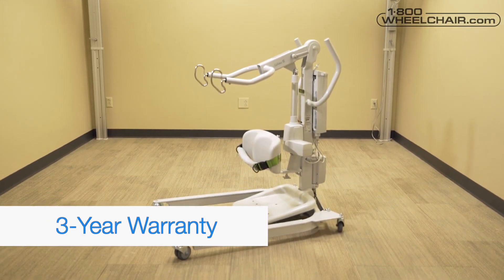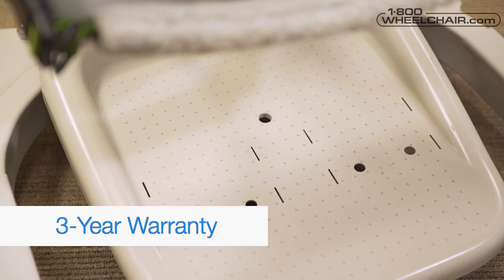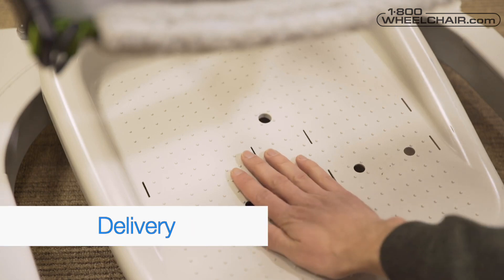Warranty: we have a three-year warranty on the frame. White glove delivery: there's an option for home delivery and setup if you need the extra care. What sling should I use with my Sabina 2? We recommend two sling options.